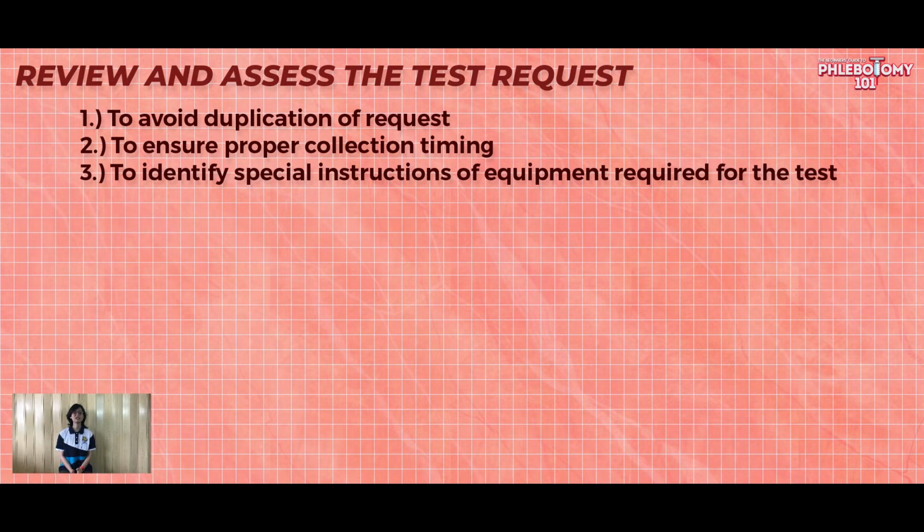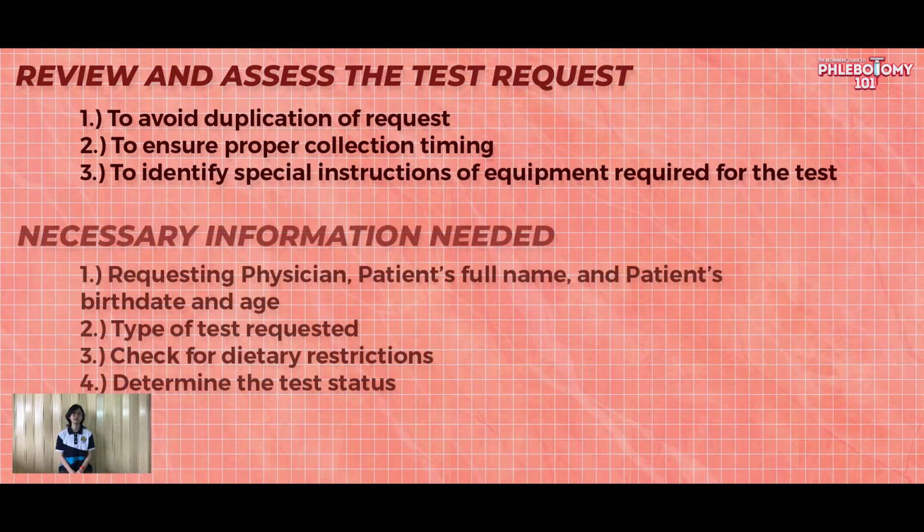Kapag titingnan na ang test request, ang kailangan nating makita ay una, kung kumpleto ba ang required information, such as the requesting physician's name, the patient's full name including the middle initial, and the patient's birth date and age. Ikalawa, kailangan din nating i-check kung nakalagay ba ang type of test requested at pati na rin ang time and date of collection nito. Ikatlo, check for any dietary restrictions or latex sensitivity, or any special precautions to be followed. And lastly, determine the test status.